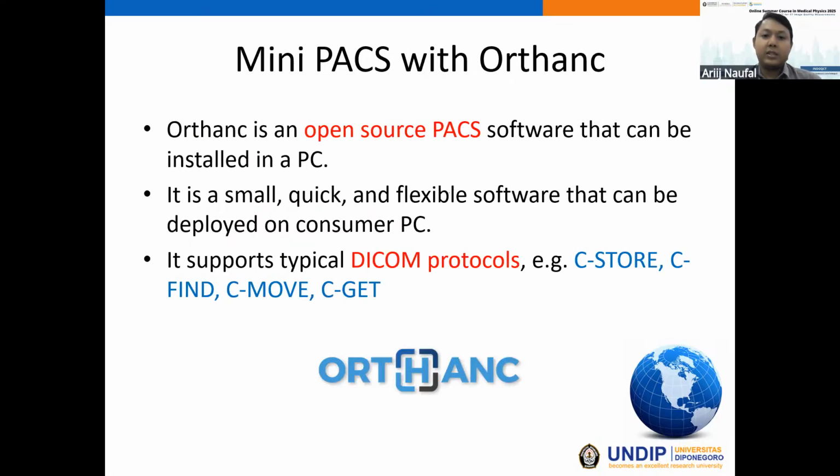The next is mini PACS with Orthanc. So what is the difference between fully operated PACS and mini PACS? Basically, PACS is a big program, big software that operates within a network. And mini PACS is a light version of it. The mini PACS is small, quick, and flexible software that can be deployed on a consumer PC. The example of mini PACS is Orthanc that we will try in this session.